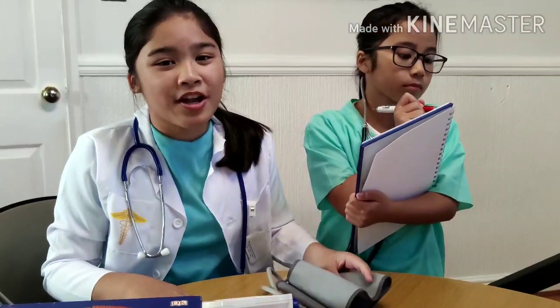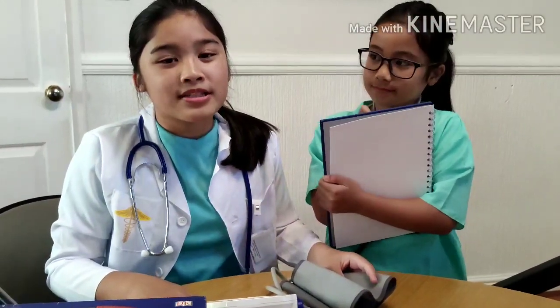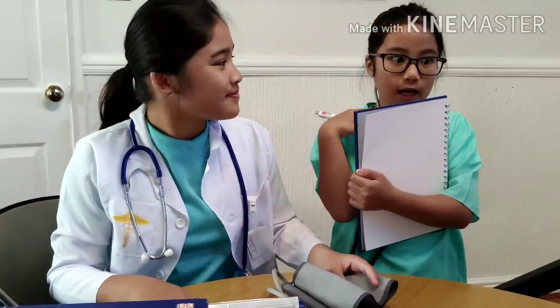When taking someone's blood pressure, make sure the patient's arm is rested on the table. Make sure they feel comfortable and relaxed. When taking their blood pressure, make sure they're not clenching their fist, because that can give you inaccurate readings.